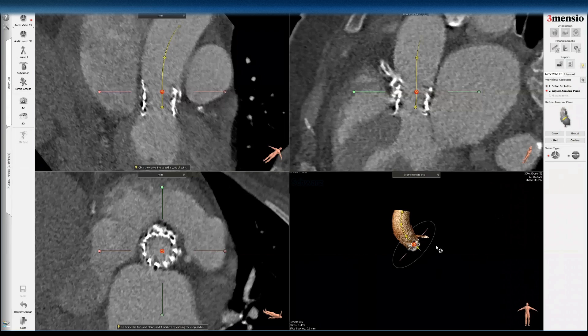If you have a pre-TAVR CT, there are certain constants such as left main height, right coronary height, or sinus height that will allow you to estimate where the annular plane might have been in this particular CT scan.